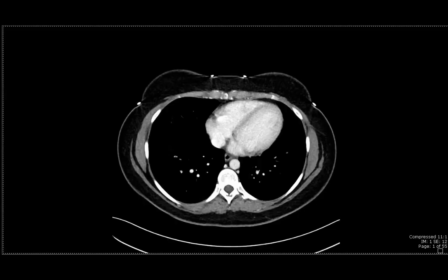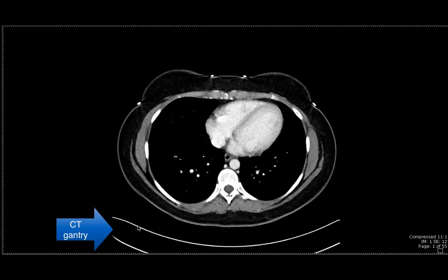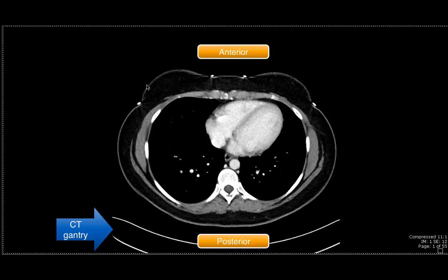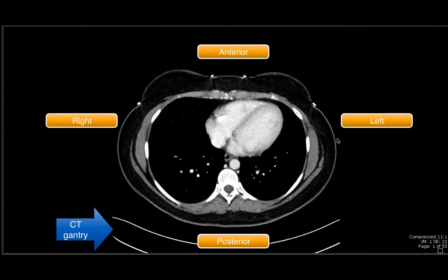I'd like to orient everybody to how the patient is positioned. This semi-lunar shape at the bottom is the CT gantry, and it's what the patient is lying on as they enter the CT scanner. This area is going to be posterior to the patient, the opposite area is anterior. By convention, this side will be the right side of the patient, and this side will be the left side of the patient.